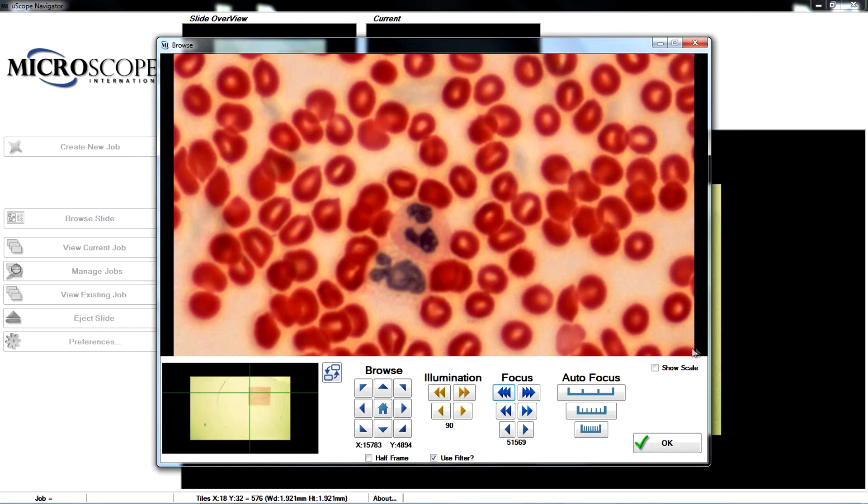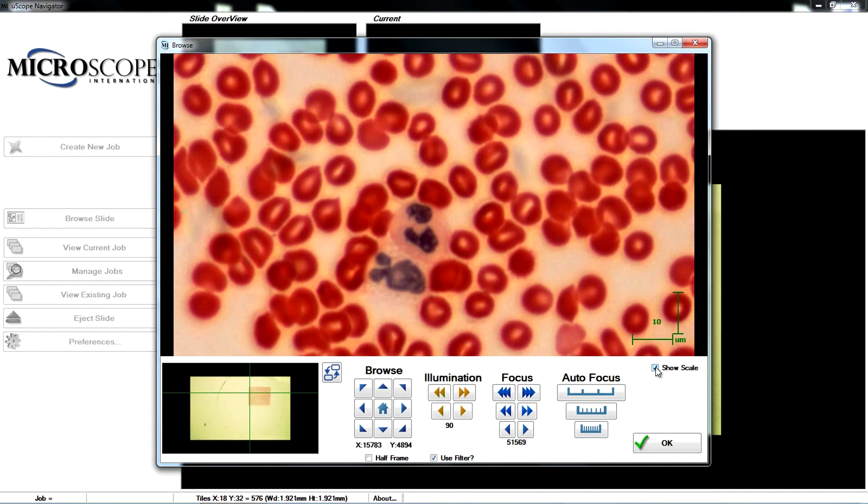The Show Scale checkbox displays a 10 micron scale in the bottom right corner of the image.